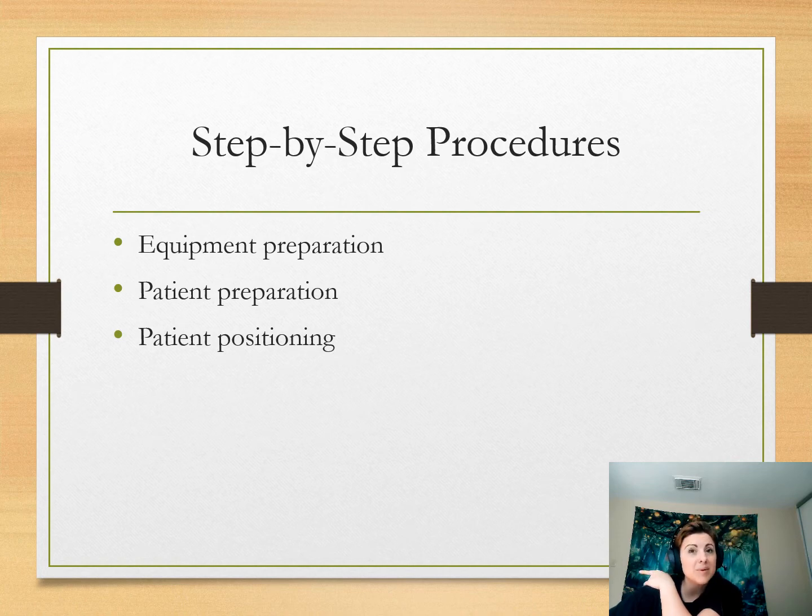Before we expose our panoramic, we have to remember about infection control. By the way, don't forget about that one. It needs to be clean. You need to set up the barriers. Then you put your patient in, you take your patient back, you clean everything up. Okay, don't forget about that. We don't really talk about it as much, but don't forget about it.